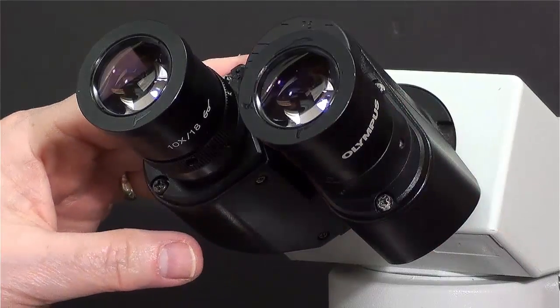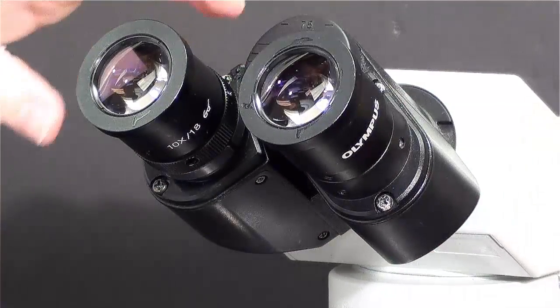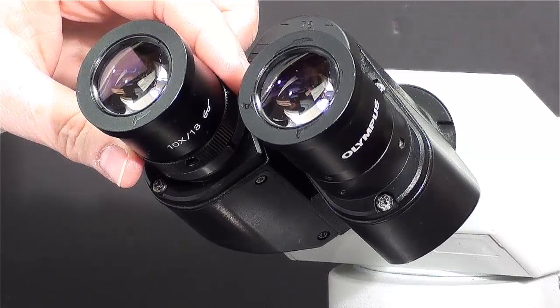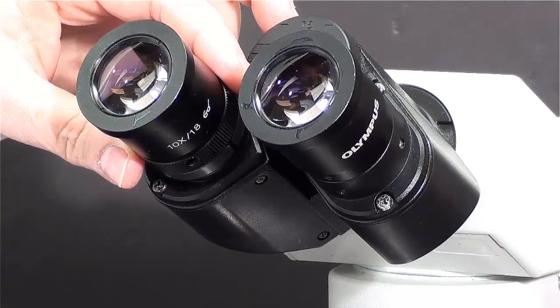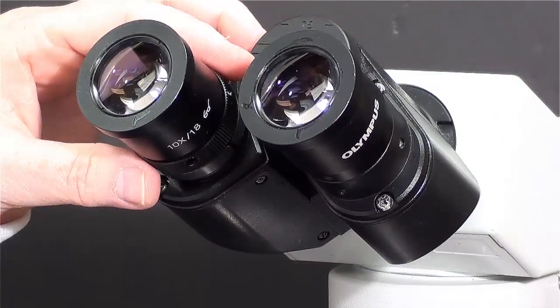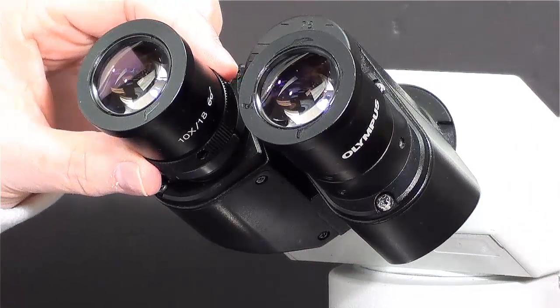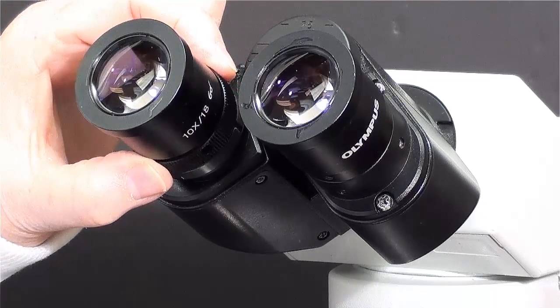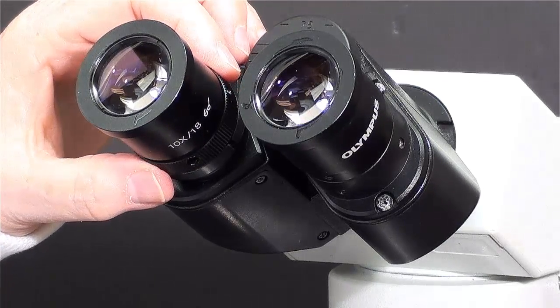An additional adjustment that you can make is found at the base of the left ocular lens. If one of your eyes is weaker than the other, get your right eye in crisp focus using the fine focus adjustment, then turn the knob found at the base of the left ocular lens. This will allow you to adjust the focus for your left eye.